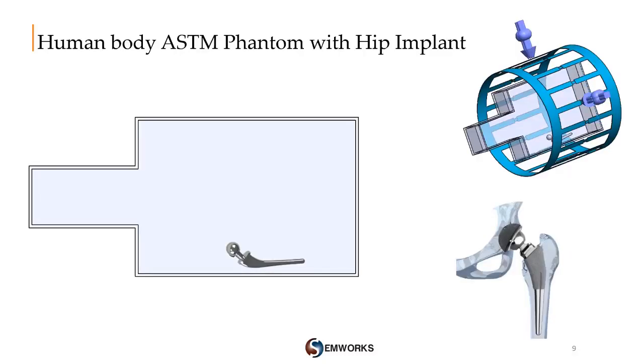Now, since we are interested in evaluating the MRI scanning of a human body with implantable devices, we will use for the second simulation a standard ASTM human phantom with a metallic hip implant. ASTM refers to the American Society for Testing and Materials. It will be used as a human body approximation, since the current ASTM norm on testing medical replacements towards MRI RF heating only recommends the use of such a phantom for experimental and numerical simulations.